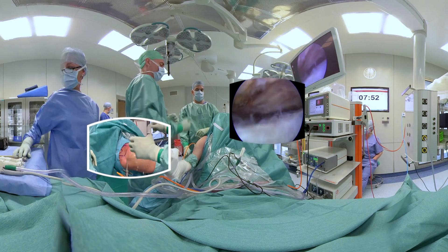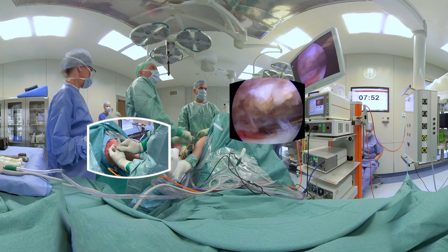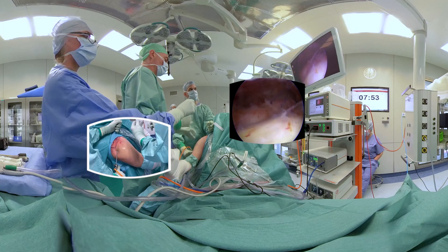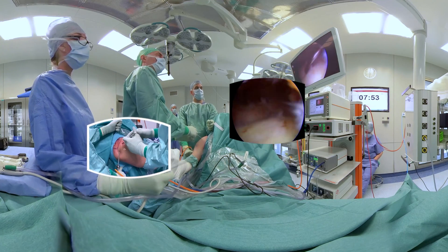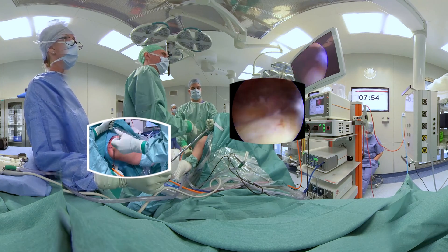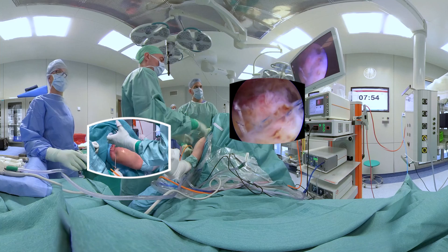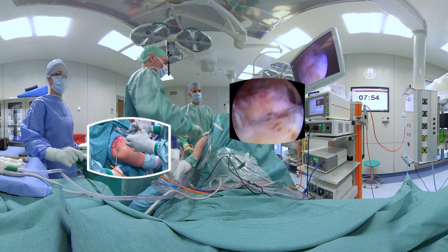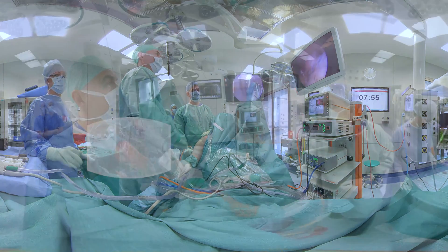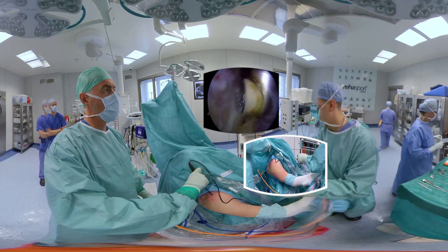We try to leave pairs of different colors from anterior and posterior anchors to get better orientation for lateral row cross-bridging. Next, the lateral surface of the greater tuberosity is exposed for insertion of knotless footprint anchors.